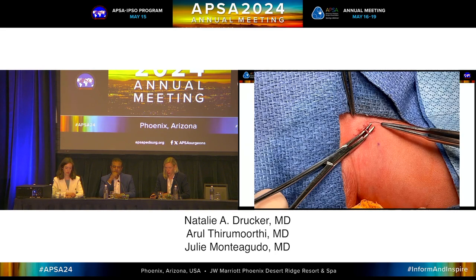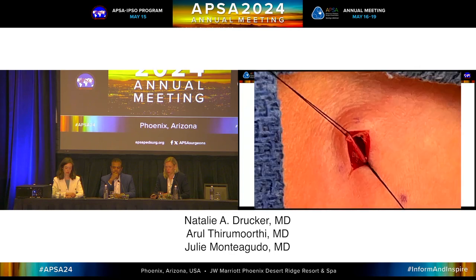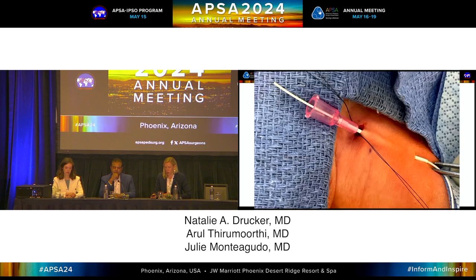So there, the vein's isolated, the hemostat's under it, it looks like a little Jake, and then a 5-0 or 6-0 silk around proximal and distal, and now you have control of that vessel. It's small, but it is open, and it goes straight into the iliofemoral system and up to the IVC. So then you prepare your tunnel.